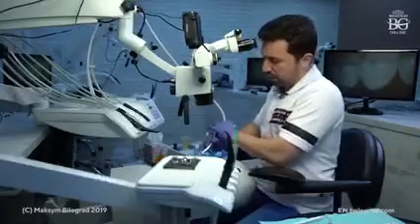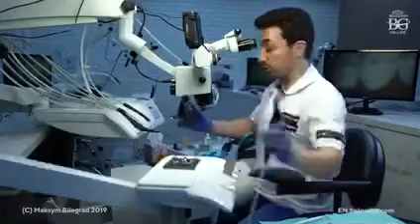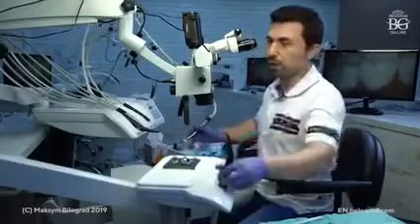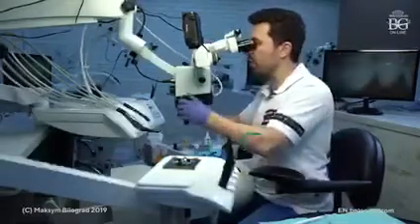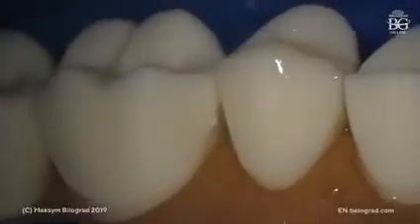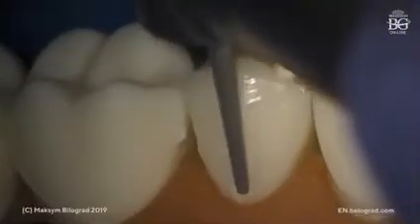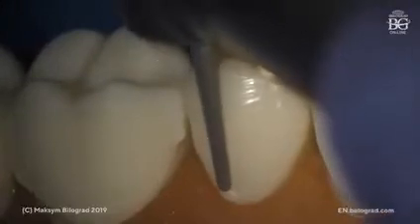Okay, so let me continue with the premolar. Let me just rinse and dry this one. Okay, fine. So we can continue with this premolar, and the same sequence. We just reposition the cervical finish line a little bit more down. Is it in focus? Not really. Yeah. So let's go. Move our finish line more down. Half of the burr or less.